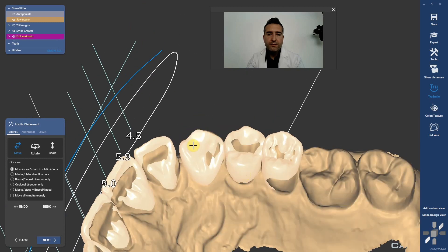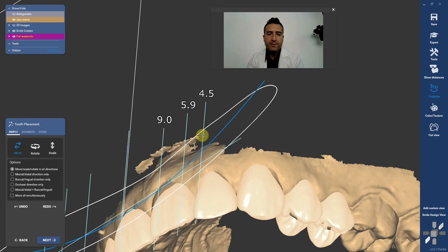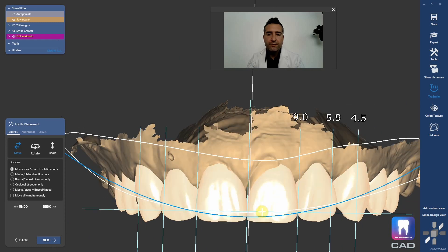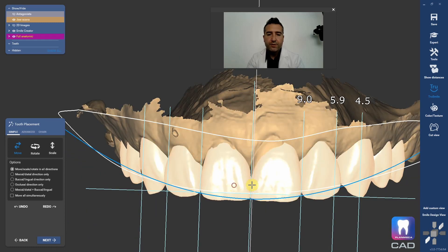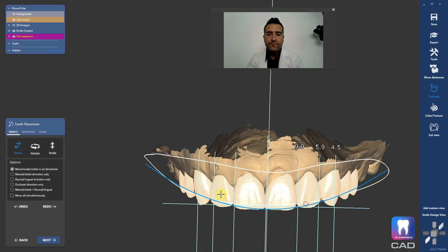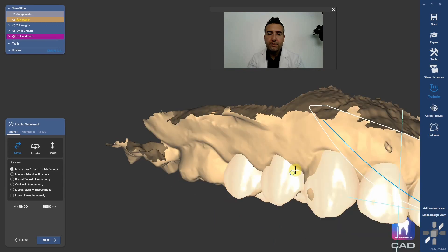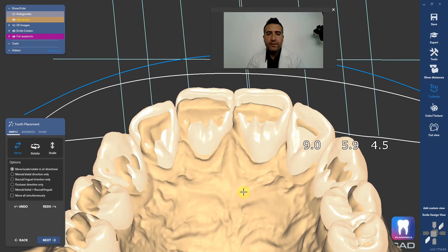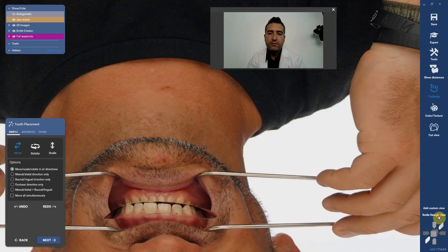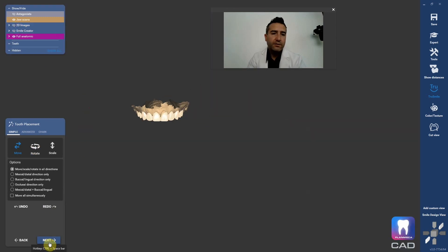I usually fudge with the canines a lot if I have a tooth-size discrepancy. I really like central dominance, so oftentimes I'll make the centrals bigger. If you're going to fudge with symmetry, lateral incisors — I'm going to do some simulated crown lengthening up here. Once I have that looking good, I'm going to go ahead and take a look at the smile, then turn all these things off and hit next.